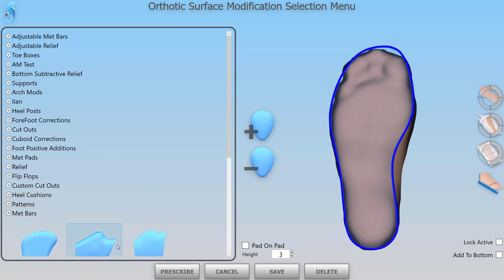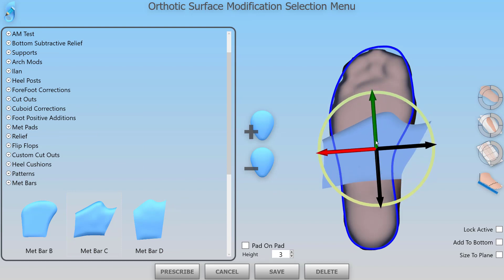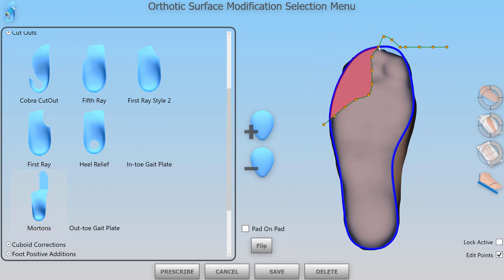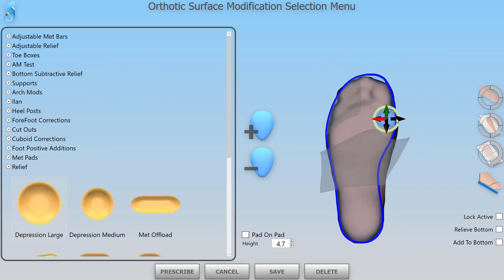For those of you making positive molds, version 3 adds a huge amount of functionality. In the past we were very restricted on what features we could add into a positive mold — in fact we could only do relief really, and a few positive shapes. In version 3 we can add all of our surface modifications and it will trim them.